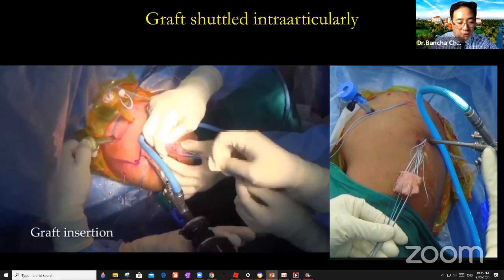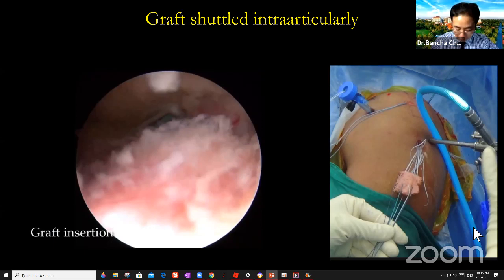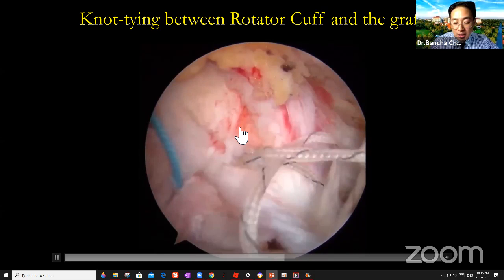Then put the graft in. Okay, then the graft is coming inside the joint. And the next step is you need to do the side-to-side repair like this. So when you do side-to-side repair, yeah, the graft will be spreading, you see? It will be in order.